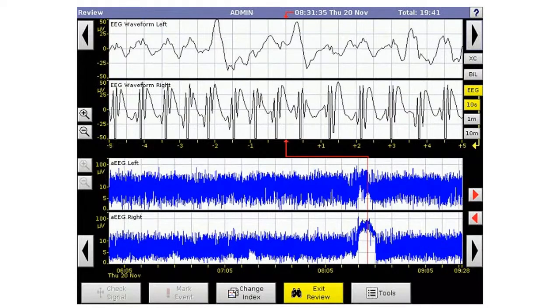This is what causes that crescendo at the top. And then the amplitude begins to decrease. The differential between the highs and lows still stays very small. And so we have here this narrow bandwidth that then extinguishes and goes back to baseline. So we're looking for a rise in the upper and the lower margins. We're looking for a thinning of the band, representing that the voltage itself is actually becoming more similar.